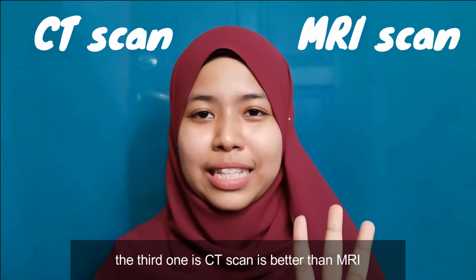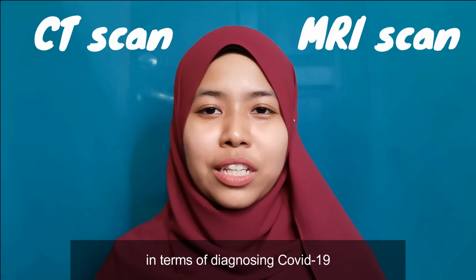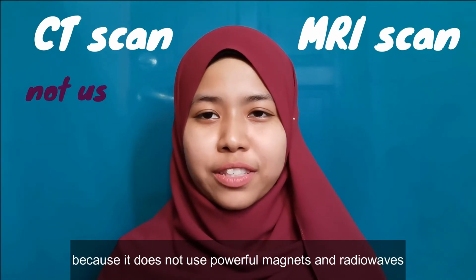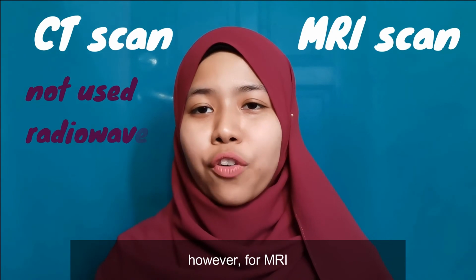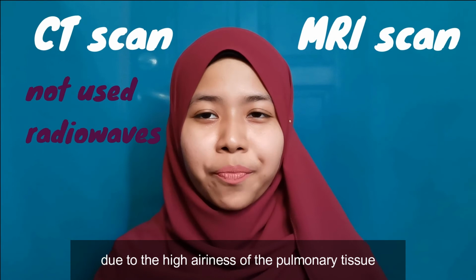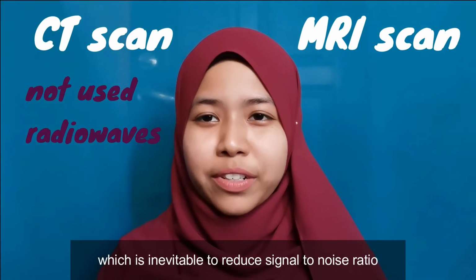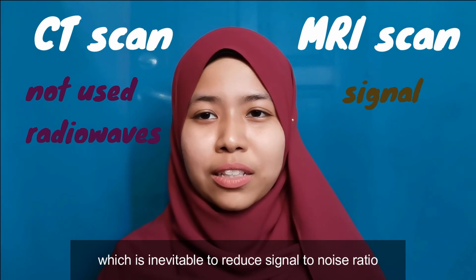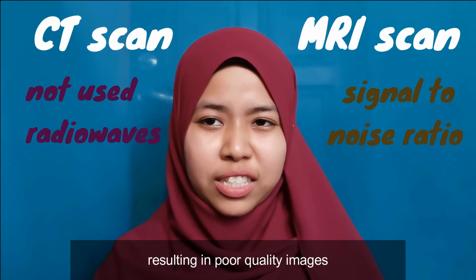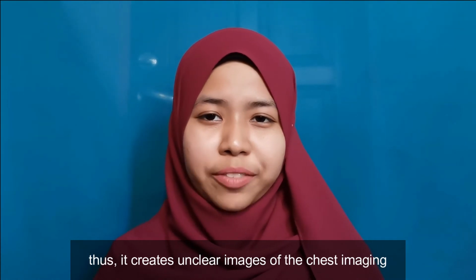The third one is that CT scan is better than MRI in terms of diagnosing COVID-19 because it does not use powerful magnets and radio waves. However, for MRI, due to the high airness of the pulmonary tissue, fewer water molecules form a signal, which inevitably reduces the signal-to-noise ratio, resulting in poor quality images. Thus, it creates an unclear image of the chest imaging.